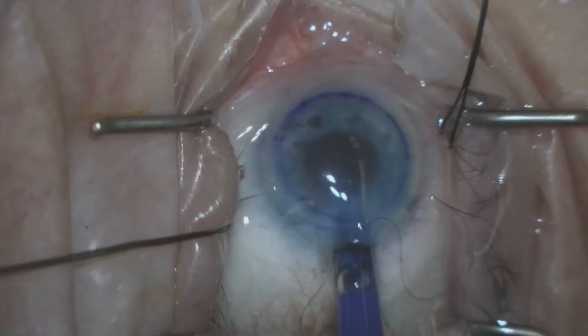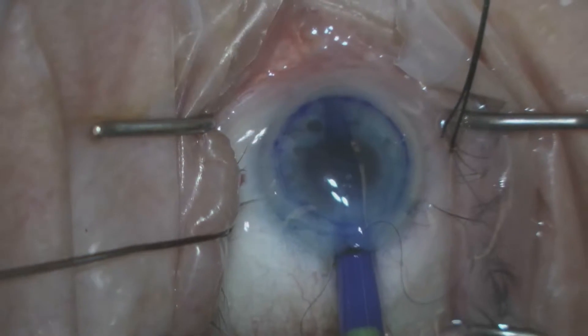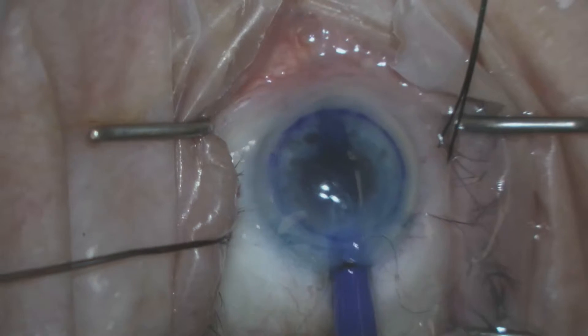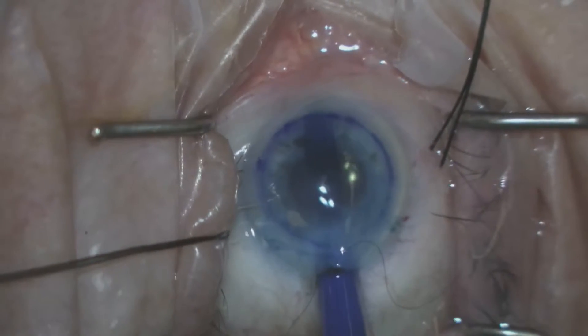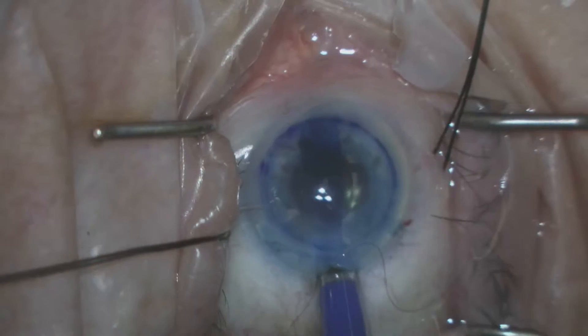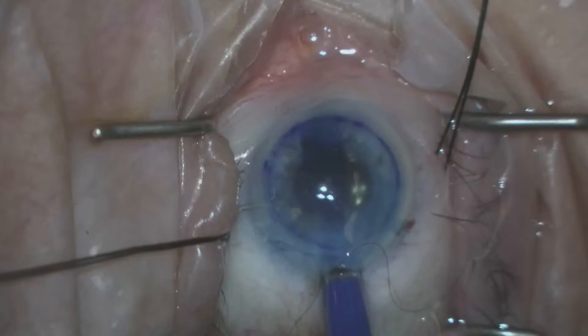A 2.8 millimeter corneal incision is made. Through that incision we inject the donor scroll. A 10-0 nylon suture has been pre-placed. The eye is hypotonus during injection of the scroll.